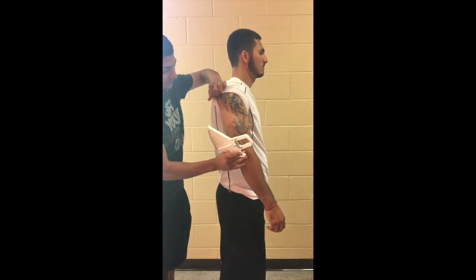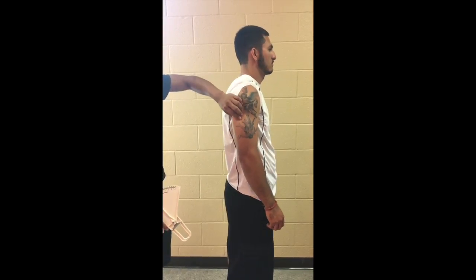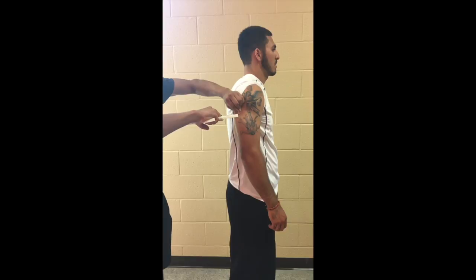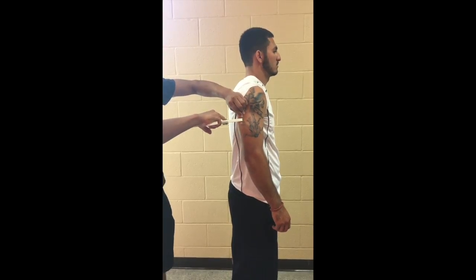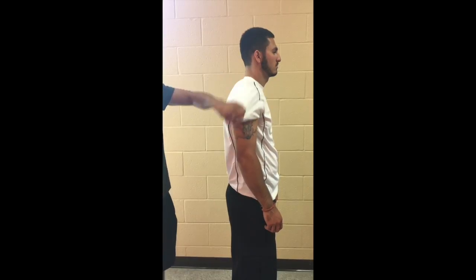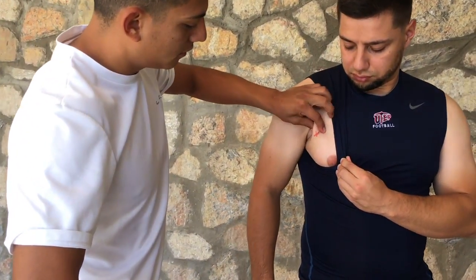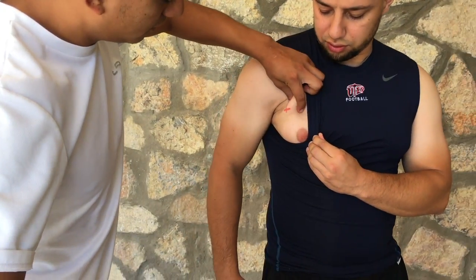The tricep will be a vertical fold measurement. The chest or pectoral site is a diagonal fold measurement.